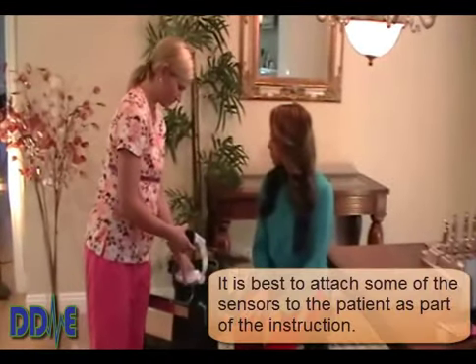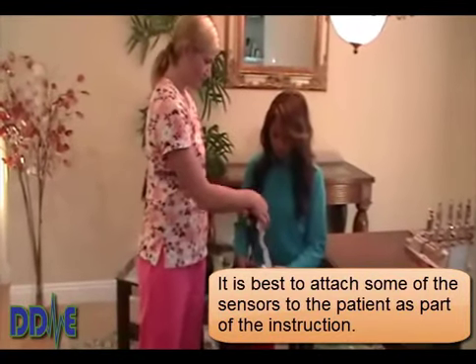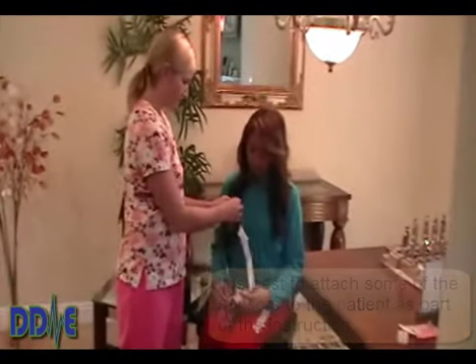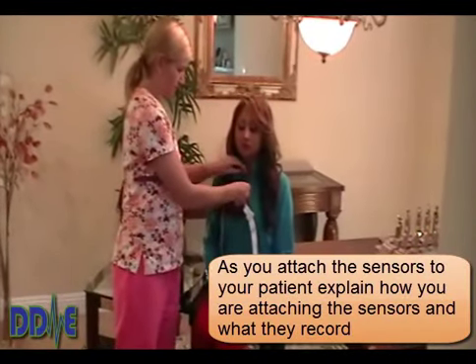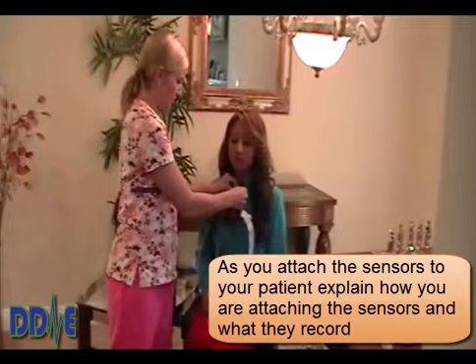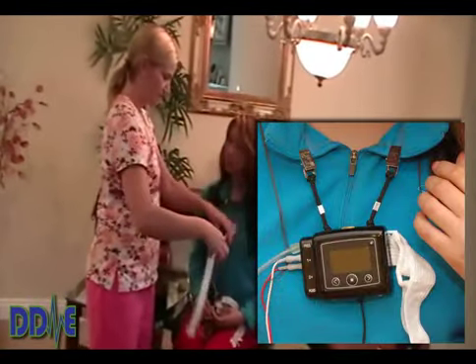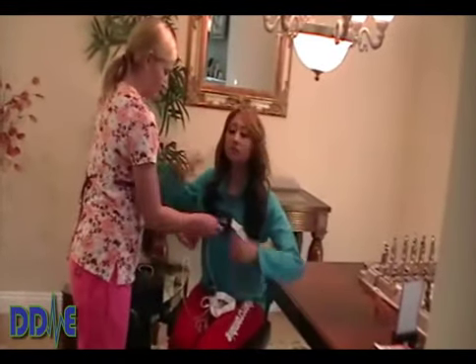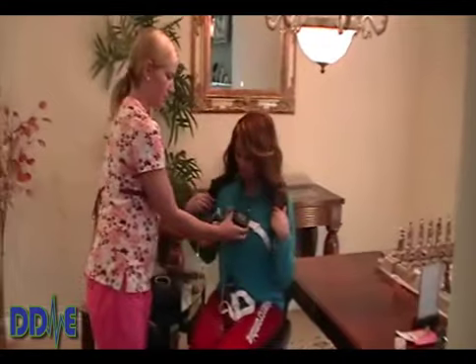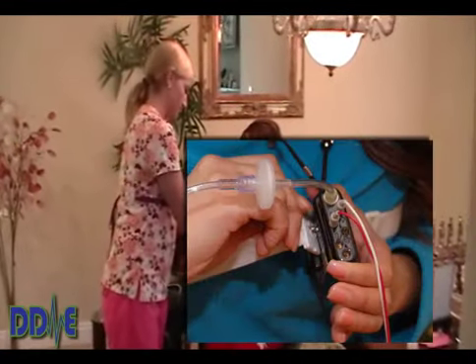We recommend attaching some of the sensors, but not all of them. Be sure in the instructions to clip the T3 to the patient's shirt — this will give them a sense of how the test will work when they go home and go to bed. Make sure they understand it hangs around the breastbone, and wrap the thoracic belt or chest belt around and let them practice snapping the belt to the back of the T3, as this is a little bit tricky.